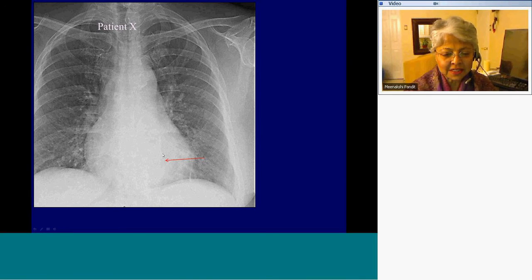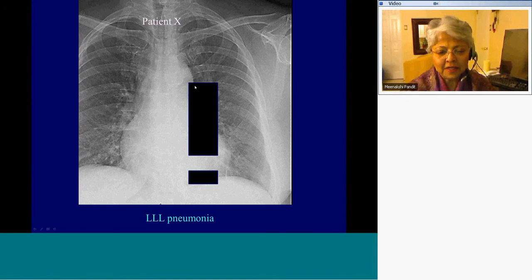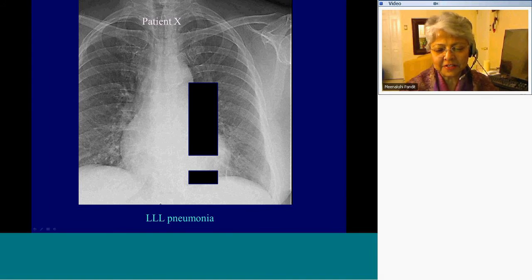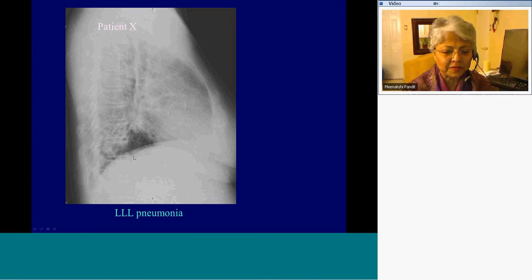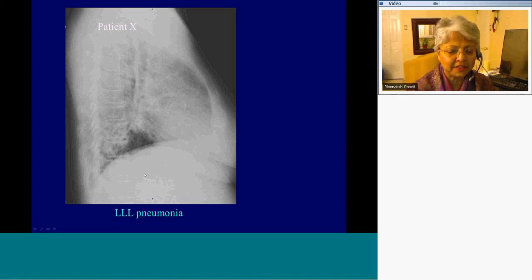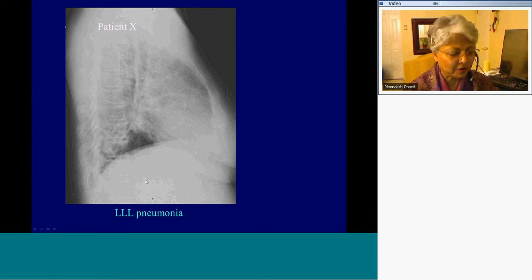You are either connecting this spot and that spot, but in reality nothing exists between them. And this is left lower lobe pneumonia. If you cover the interface above and below, you realize you do not really have a continuous interface — that corroborates our suspicion for left lower lobe pneumonia. That patient also has a positive spine sign and silhouetting of the left hemidiaphragm. You cannot trace the left hemidiaphragm beyond a certain point — you should be able to trace it all the way to the costal margin. The right hemidiaphragm is seen all the way going anteriorly.